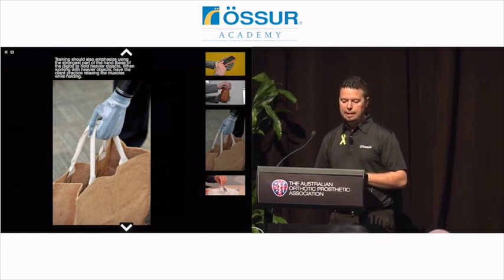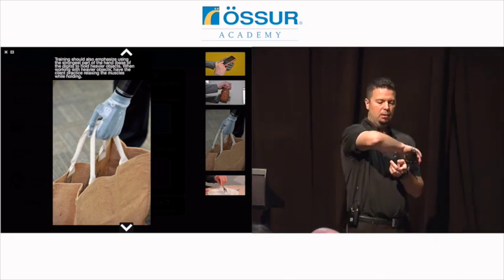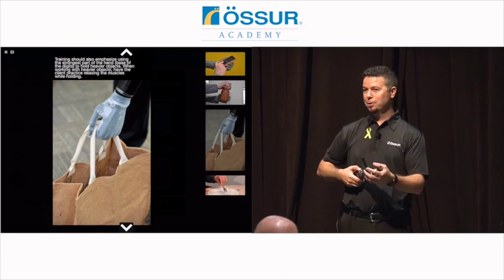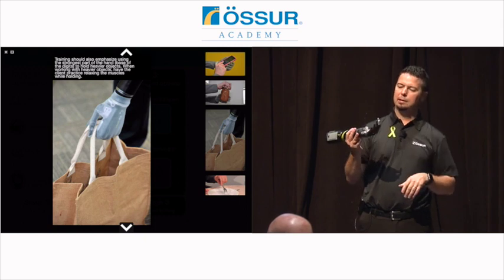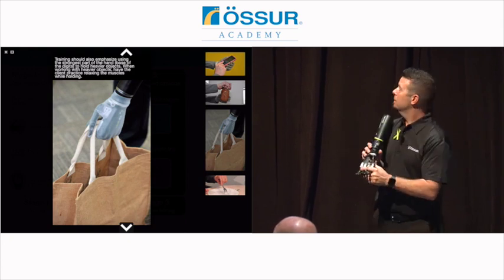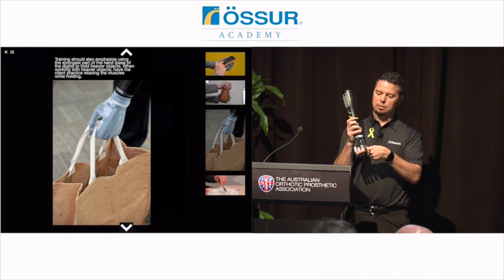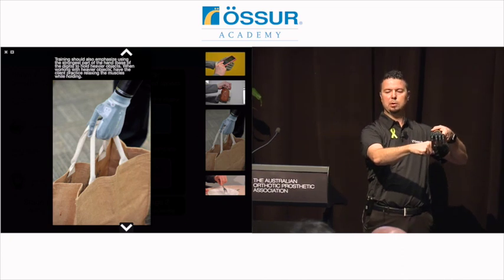And then we also look at where we put the forces of the hand. You and I would not want to carry a laundry basket or something with weight on the tips of our fingers, or a grocery bag, right? That would hurt. We'd feel that. The hand would hurt too, but they're not going to know that the hand hurts. So we start off by showing them the strongest points of the hand, and that's typically going to be right in the base of the finger, right in the palm. And things with handles like your grocery bags or maybe a purse, pocketbook, that kind of thing, making sure that they understand to put that weight into the base of the finger when they're holding it, and not to hold it maybe like in this palm down position where the weight would be on the tips.